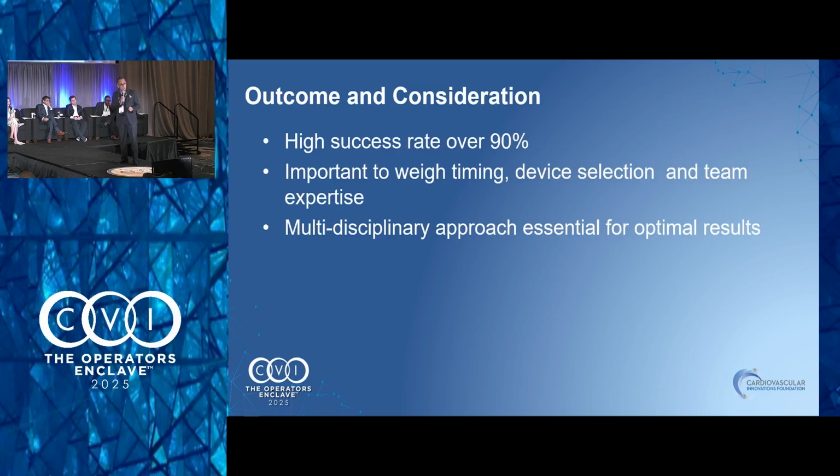She's still doing well. So in conclusion, and because timing is important, here is the question for the panel. I leave everything unless there is a significant hemodynamic change on the table, like they became hypoxic or something like that, then we'll close them. But all my Watchman cases, TMVR, valve cases, all of them, I leave them. But this is the third case within 6 weeks that I have had to bring them back and plug it.